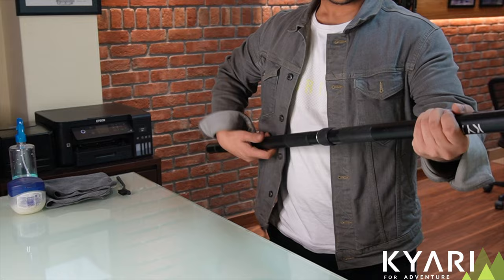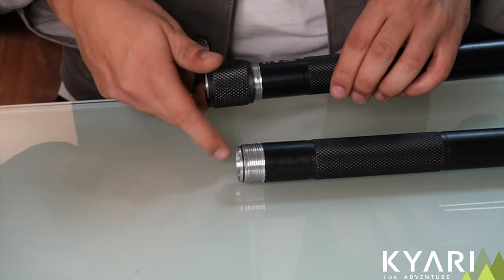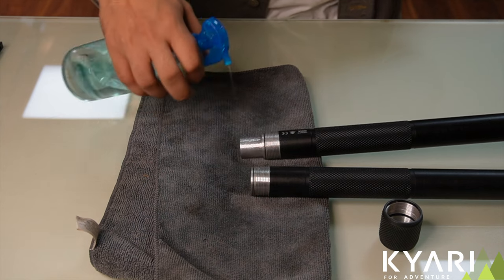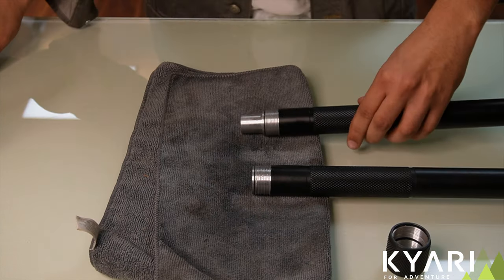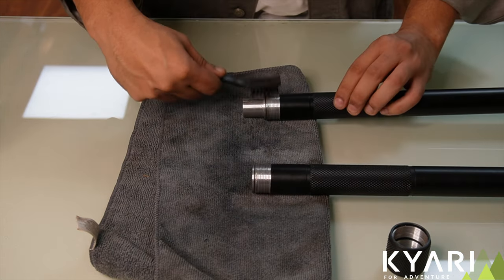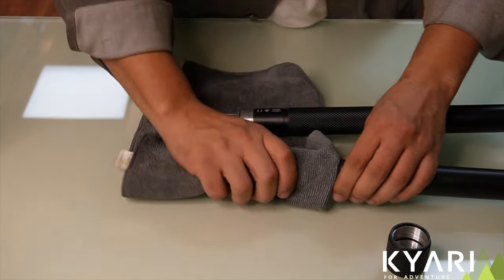Joint maintenance. First, let's start by dis-joining the stick. We will first remove the socket. Place a clean cloth under the stick and spray soapy water on the joint and on the socket. Doing this will remove all the dust particles. Use the brush thoroughly to clean the threads. Now, wipe off excess water using cloth.